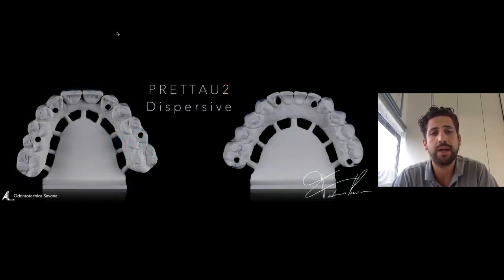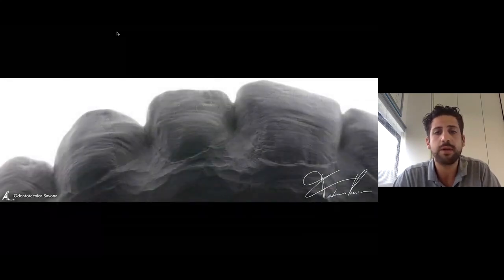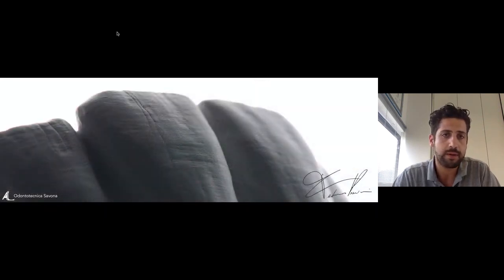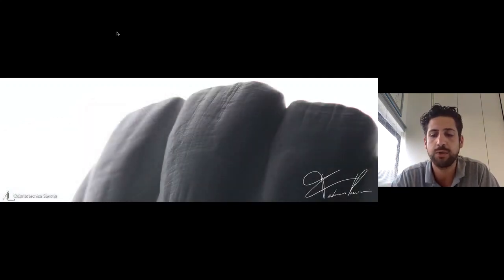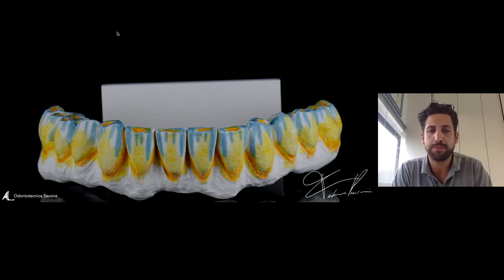And we went to mill in Prettau 2 Dispersive. Okay, there are the two full arches. We made surface texture, also some crack lines with the scalpel, and some nice pictures. Always behind we put the white light to see the contrast with our job. And this is the characterization of Prettau 2 Dispersive.